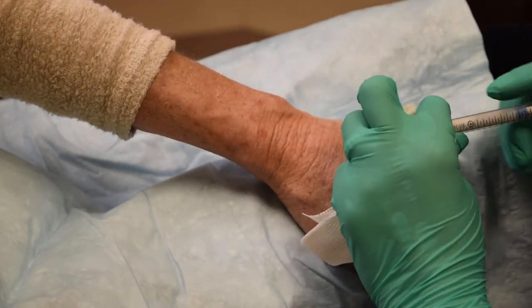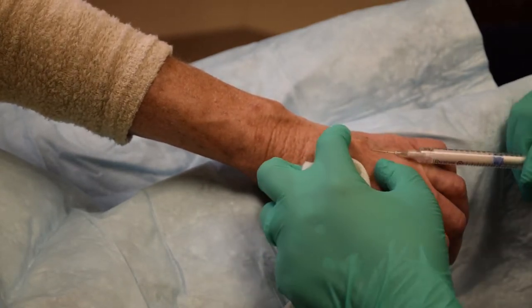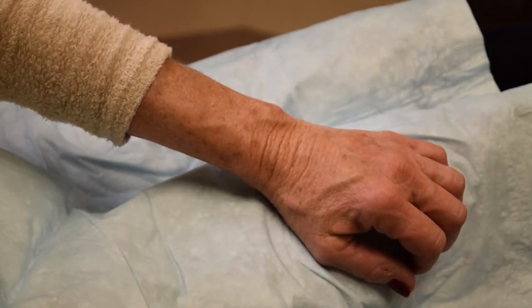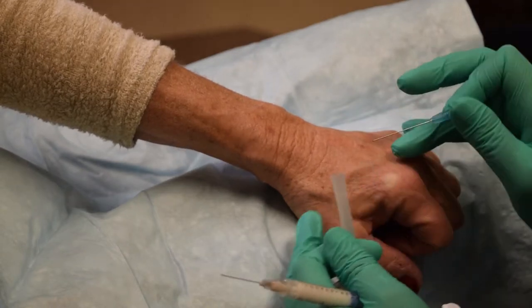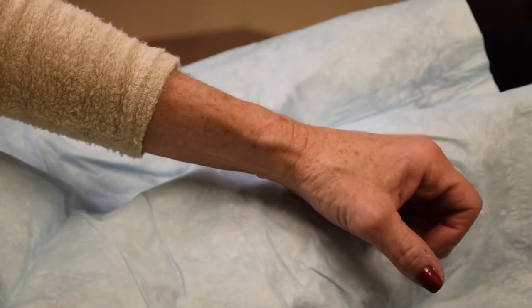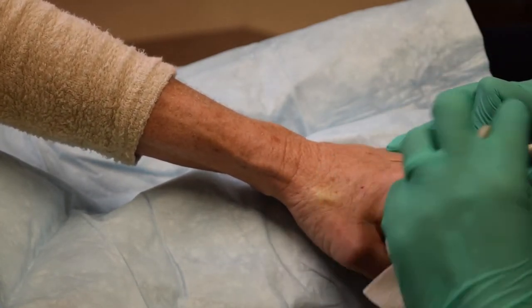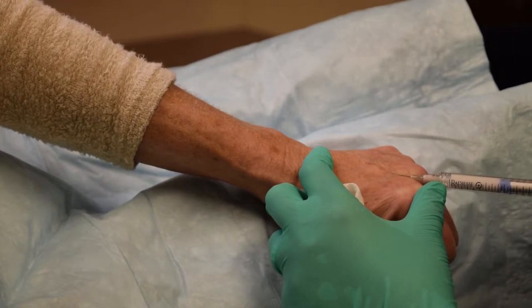The initial bolus goes in smoothly. I'll advance the cannula to go a little further towards the wrist and deliver the rest of the bolus. No blood. Once the cannula is withdrawn, the entry point is no longer visible and there is no bleeding. I'm going to correct the anatomical snuff box and the mid-hand, threading the cannula right under the skin — very superficial. You can see that bolus rising; I advance further to correct closer to the wrist.